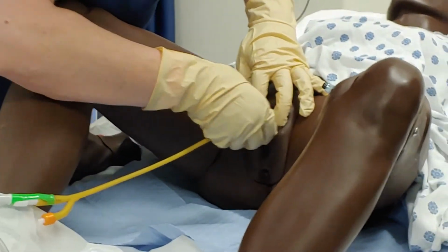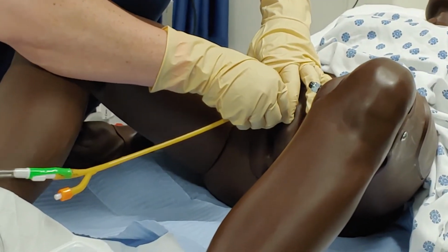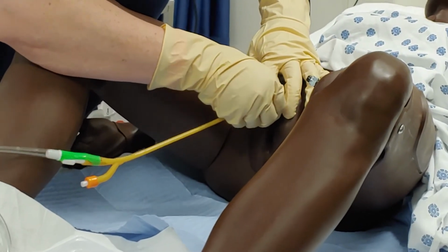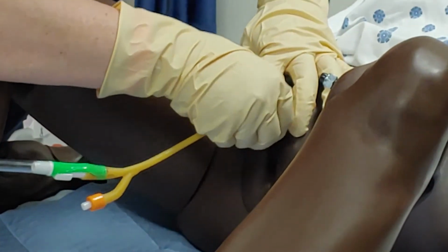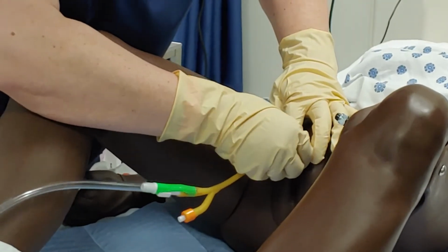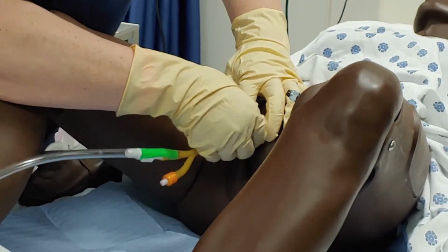And we're going to insert it. You're going to feel a little bit of resistance, and then you'll feel it kind of give, okay? So I'm just feeding this in. Yeah, I don't think you filled it enough because it should be all the way in now.